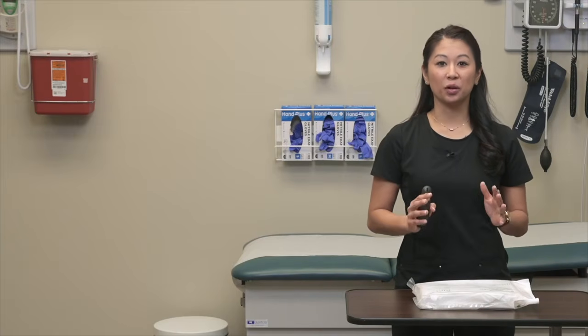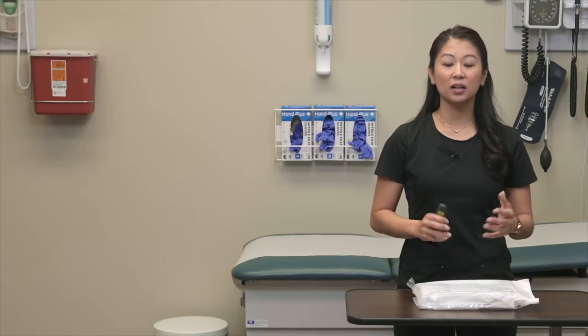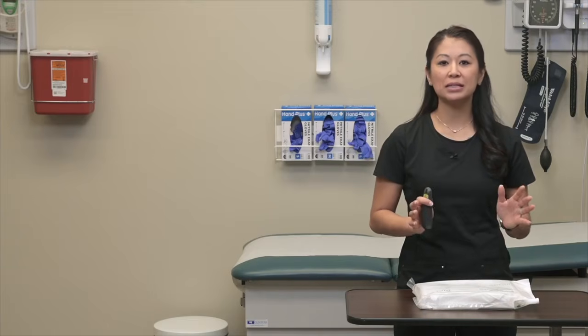Before we get started, we've got to open our sterile kit. This will turn into your sterile field, and I'll show you that shortly. Before we take off, I want to talk to you quickly about clean versus sterile equipment. Clean equipment is something you use in routine care, for example, gloves that are typically placed on the wall in your patient room. This is for routine maintenance care. Sterile equipment is typically encased in a package.